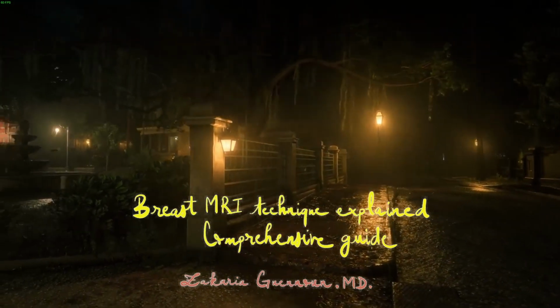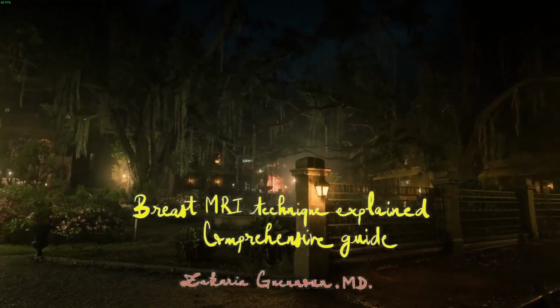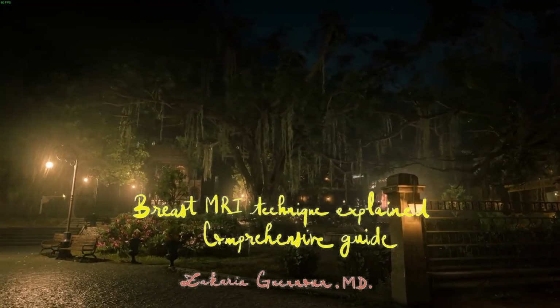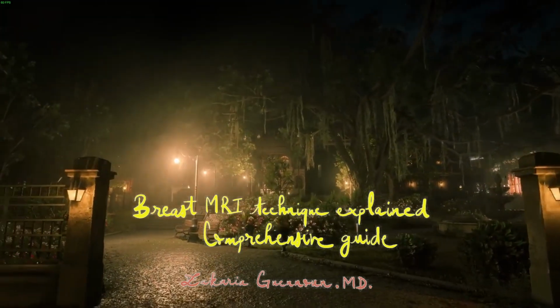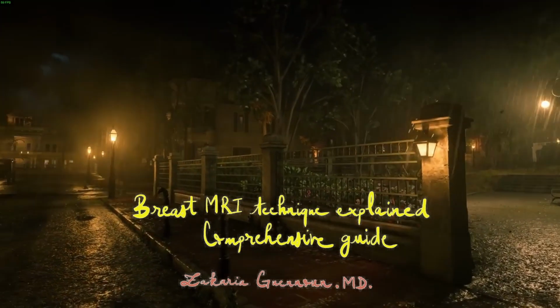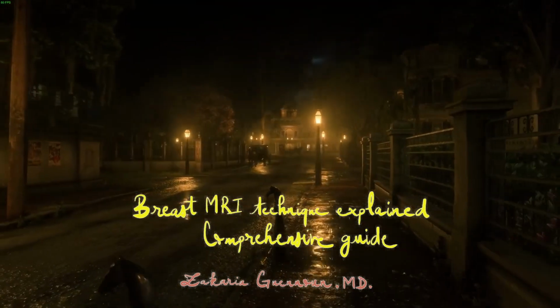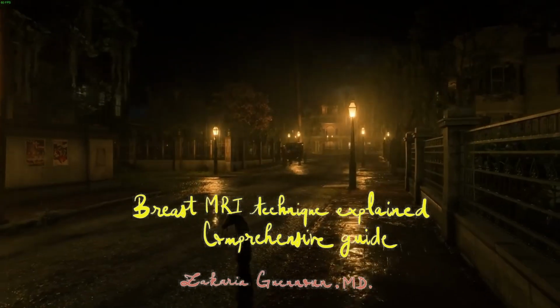We have T2 weighted images to evaluate fluid content of any lesion, T1 without fat saturation, used usually to assess any architectural distortion or any mass effect, T1 with fat saturation and without contrast injection, which will be used as a baseline to compare with T1 weighted images with fat saturation and with contrast injection.